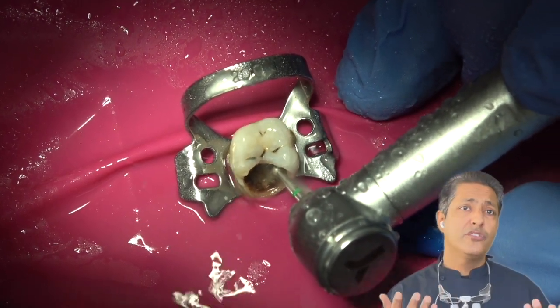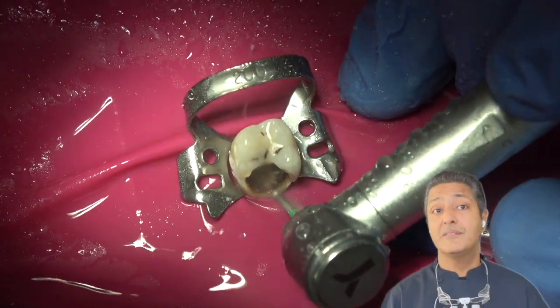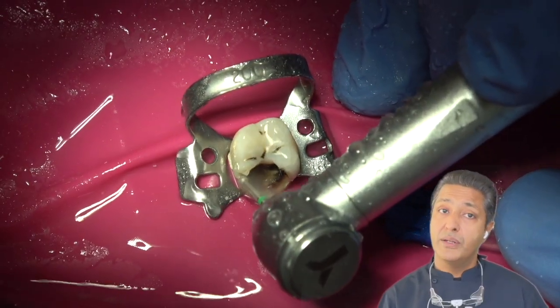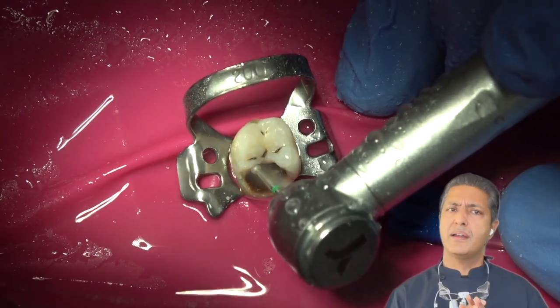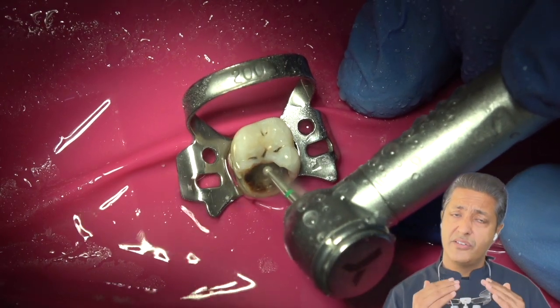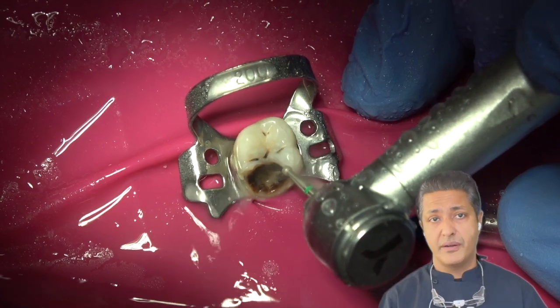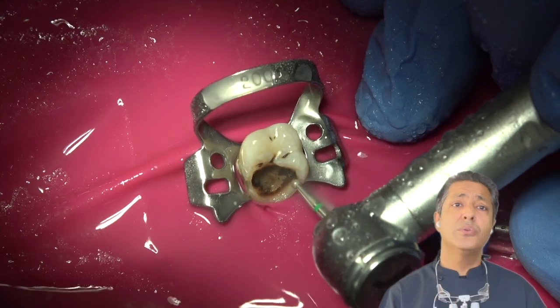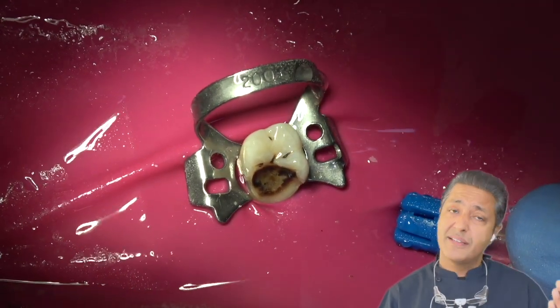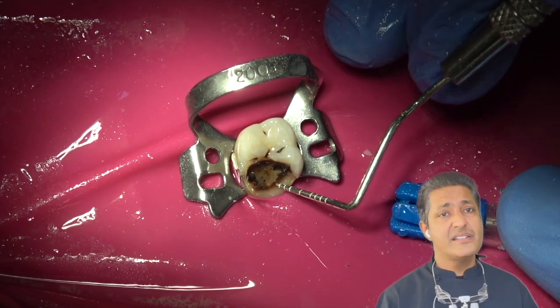It will just do its job. We just need to brush the burr. And we can control the handpiece by using a proper finger rest. As you can see on the video, we are just brushing the peripheral part, and the peripheral caries lesion by itself is getting scraped off with the movement of the burr, and that is our intention. Once this is done, we need to be sure by properly examining the area with a blunt probe, as I spoke earlier, or with a DG16 explorer.